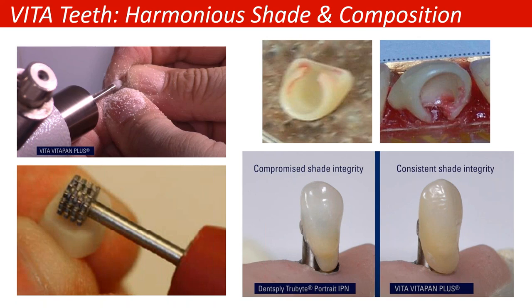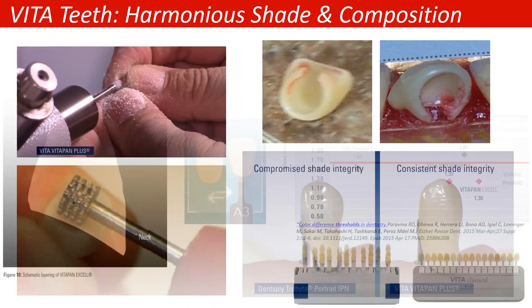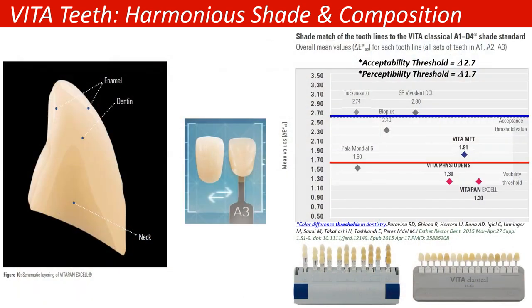It's important for us as technicians, denturists, and dentists, so that if we do any adjustment, we still see the true shade. So again, the shade from the outer side all the way to the inside, the middle, if you will, is consistent and doesn't lose the chromaticity that it requires. And if you look at, for instance, just documentation, we as humans can visualize and see the difference between two colors or two different shades.